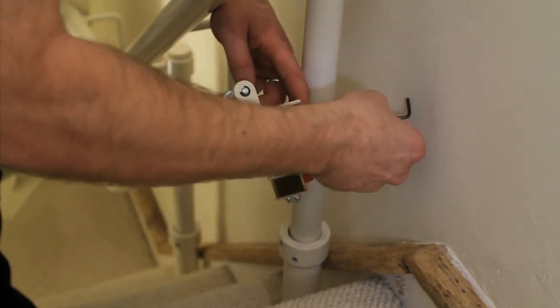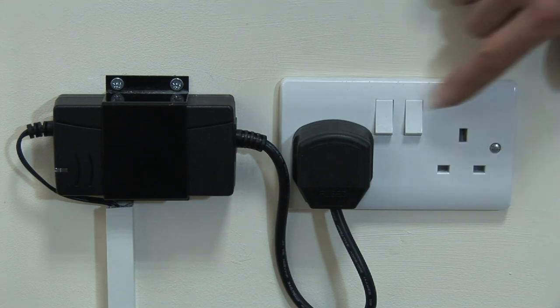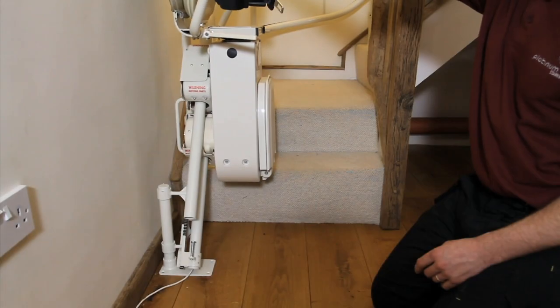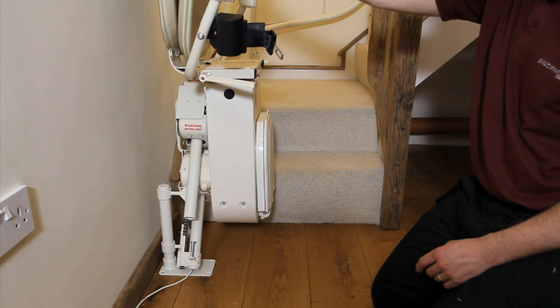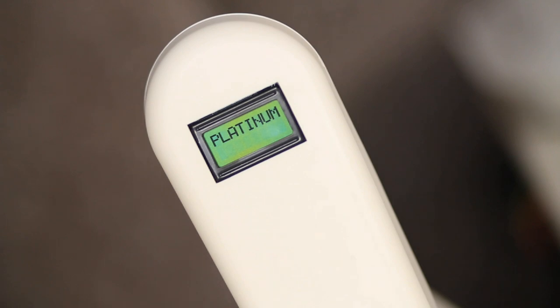When you are happy with all the wiring connections that have been made, simply turn on the power supply and check that the carriage charges correctly, both at the top and bottom charging points. When the stairlift is ON charge, the display will read PLATINUM.